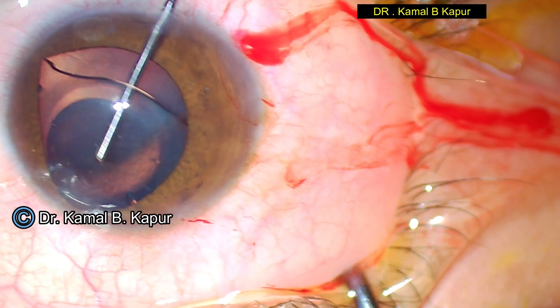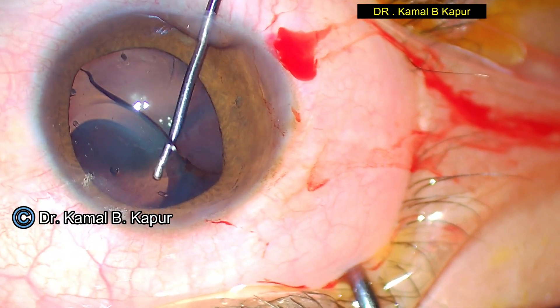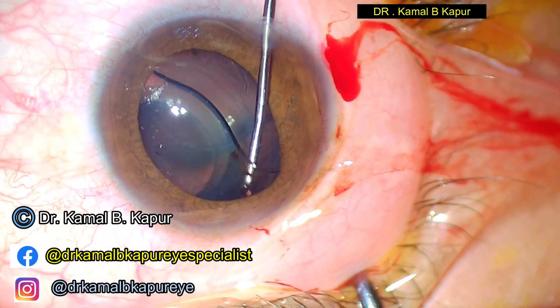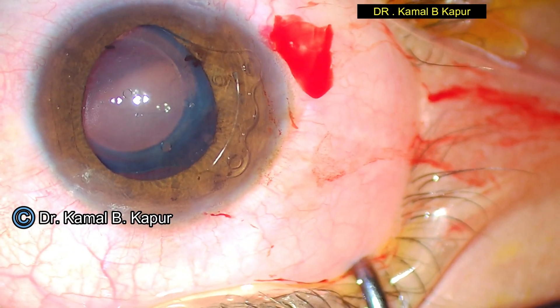We go behind the phakic lens without touching the crystalline lens, reach the middle of the central part of the optic, and slowly nudge out the phakic lens from behind the iris and bring it on top of the iris.